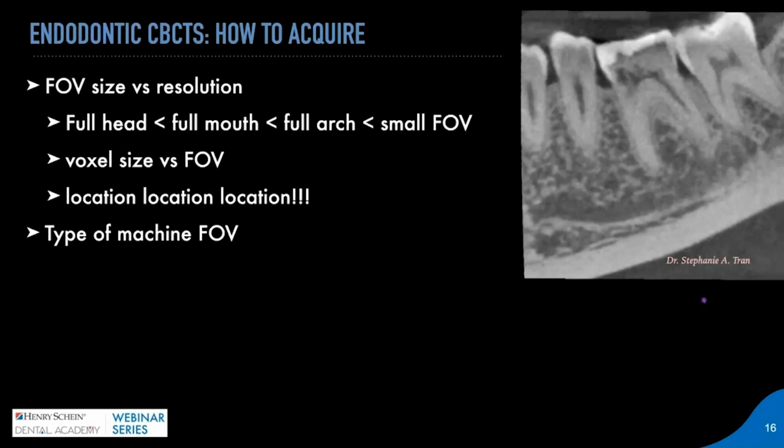So the larger the field of view, the poorer the resolution. Like, the fuzzier, the grainier it is. It's like comparing an HD picture of intraoral photography compared to just a general point and shoot or like an iPhone 6. It's a lot grainier, the resolution is poor, you can't see as much detail. We want to see as much detail as possible in endodontics for better diagnosis and treatment planning.